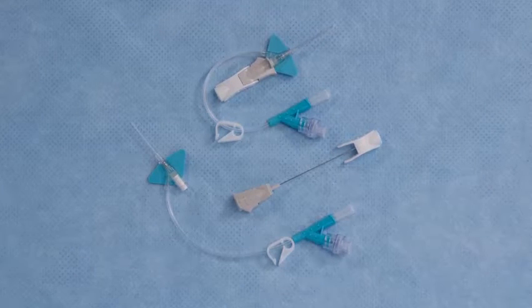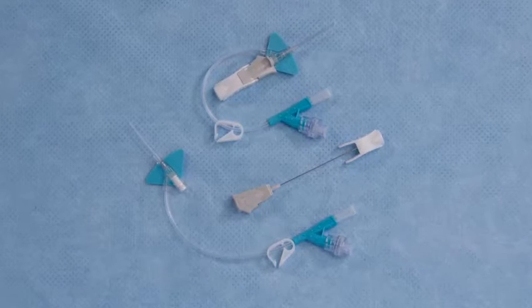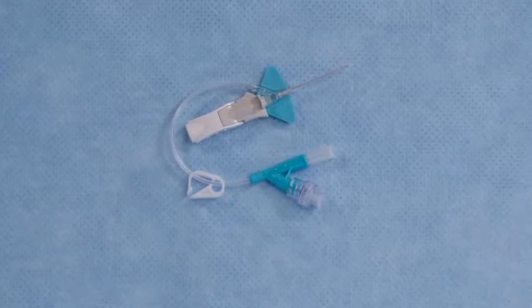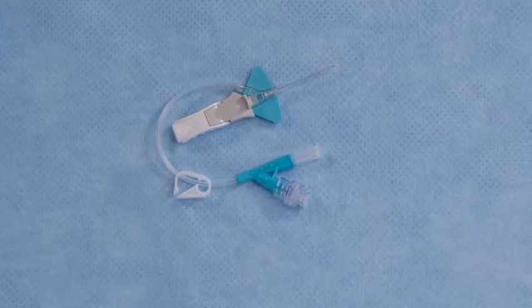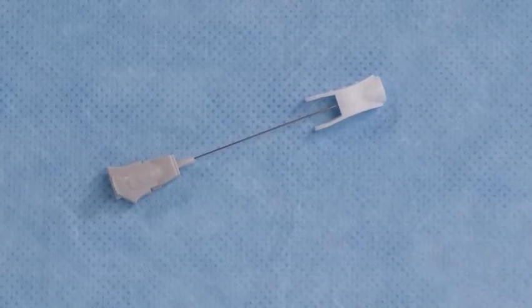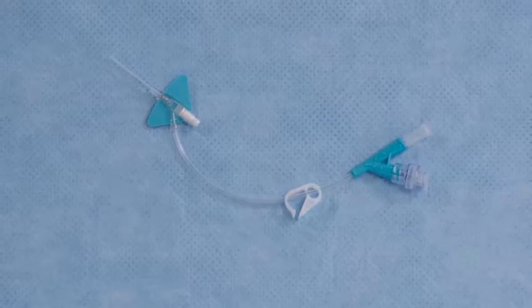Talking with hundreds of clinicians in various practice settings led BD to develop the profoundly simple yet groundbreaking BD Nexiva closed IV catheter system. The first of its kind, this all-in-one system is designed to reduce insertion attempts as well as reduce your exposure to blood.